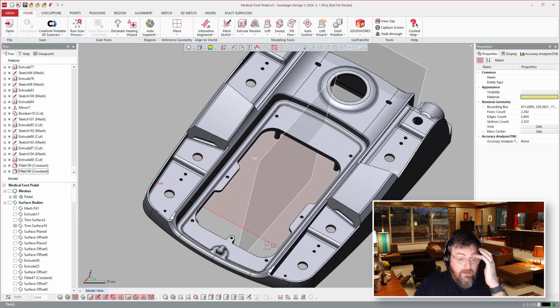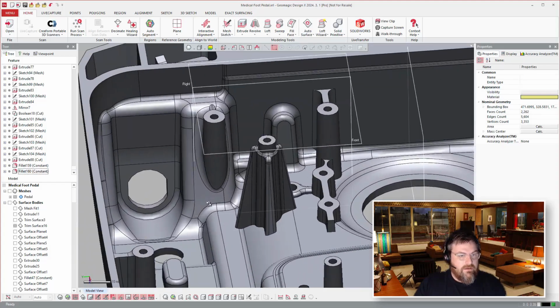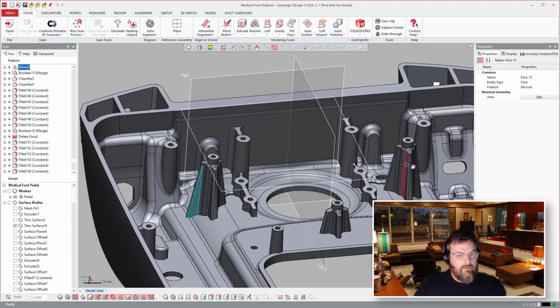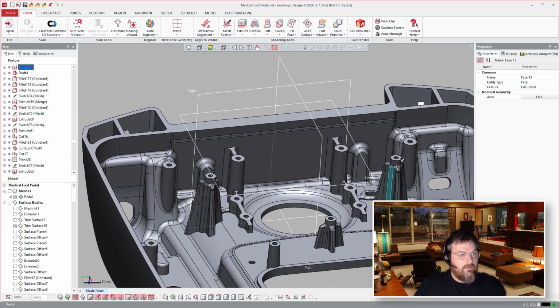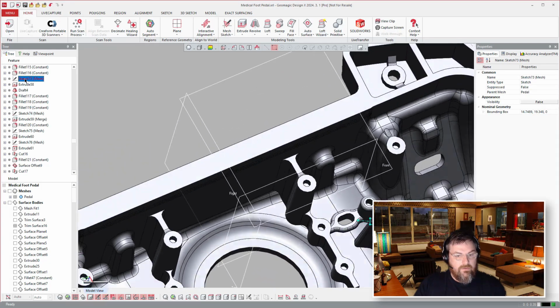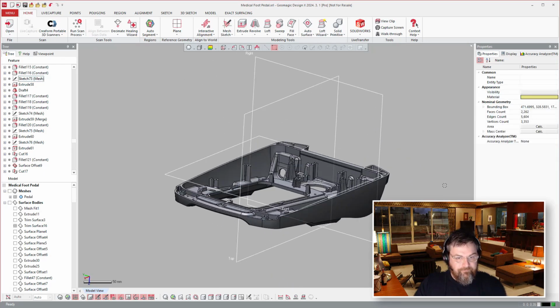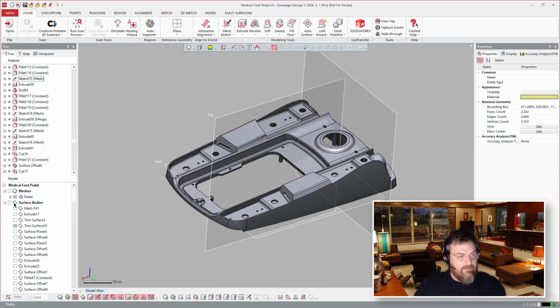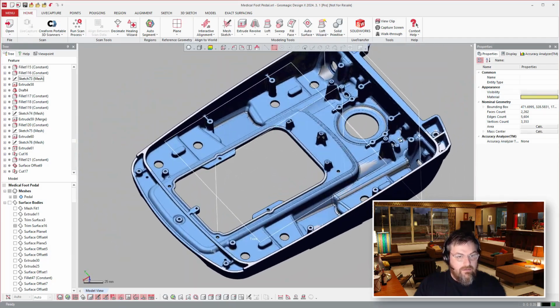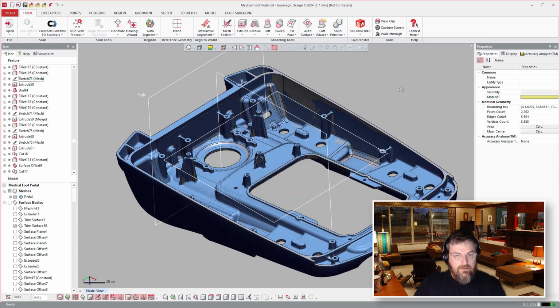Lots of hole cutting and minor dress up features here. But we'll just click on some of these so you can see where they were in the tree. So if I just click back, that was part of the mirror. So maybe we're here. Extruded. Here's the sketch associated with it. And come back and add draft to it. But you see here, that is the complete model. So we'll go ahead and toggle on the mesh and see how much work was done.